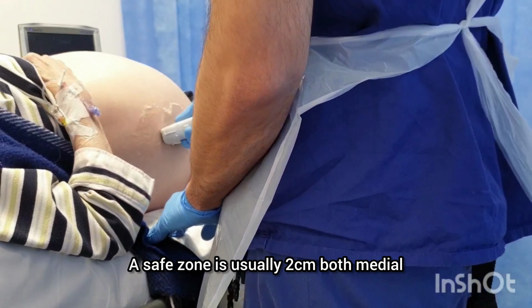Initially, you will insert the drain by tipping it into the incision. Now, keeping the drain perpendicular to the abdomen, you will control the distal drain with your non-dominant hand, which will grasp the drain with the thumb and index finger. Your non-dominant hand should not move.